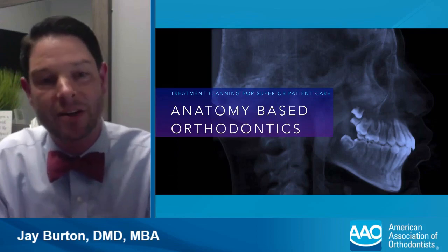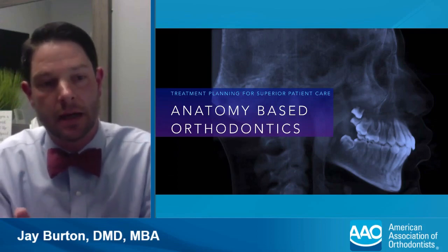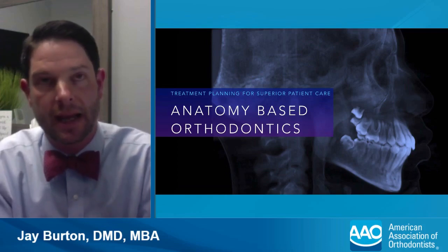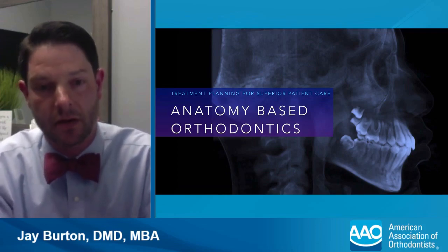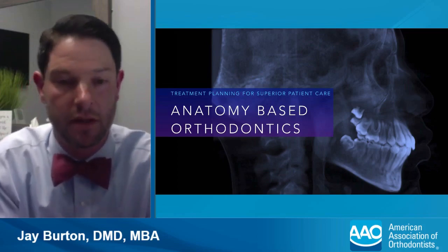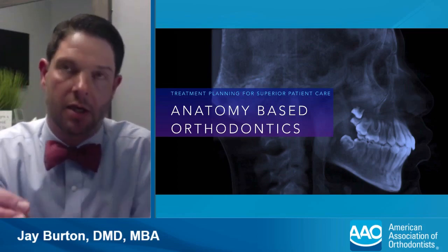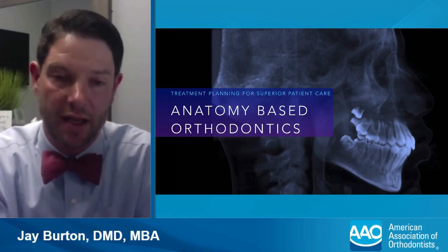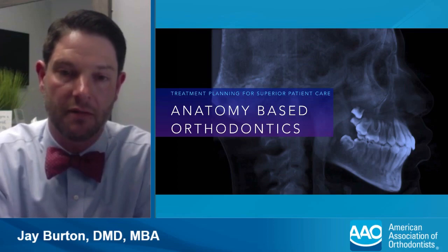Part of the reason that it's a matter of when is because you can do anatomy-based orthodontics. You can look at the alveolar housing that holds the teeth, which means you're able to plan treatment and provide treatment in a way that maintains the health of that patient.